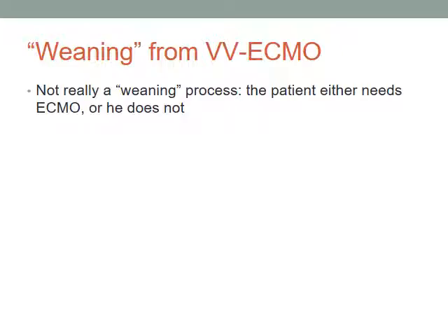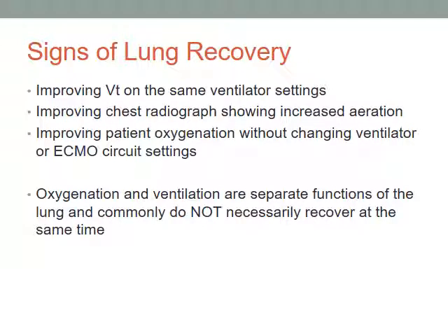So what we'll see is the tidal volume on the same ventilator setting will improve. Instead of being 27, one day there'll be 100, and the next day maybe 150. And the x-ray, instead of being completely opacified, oh look, there's some air there. And the gases start getting better. On the same settings, we'd start noticing the PO2's going up or the CO2's going down. That's because the ECMO circuit is doing the same thing, but now the lungs are doing a little bit more. So we'll start seeing improvement in gases as a clue.